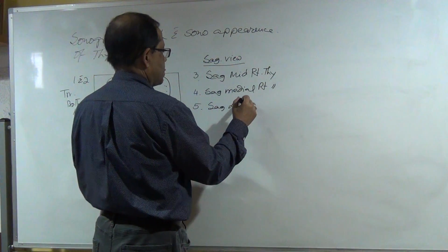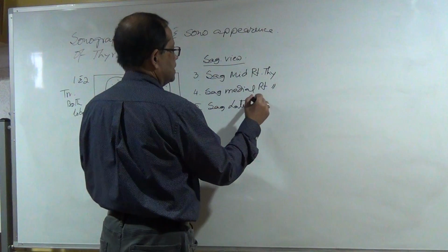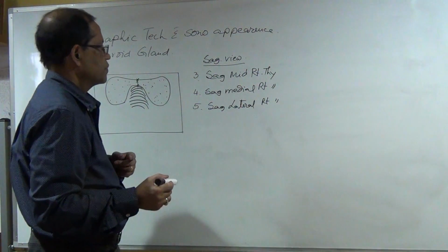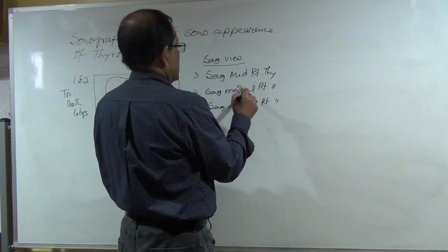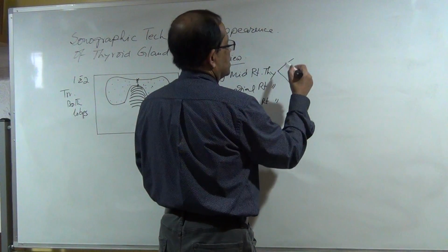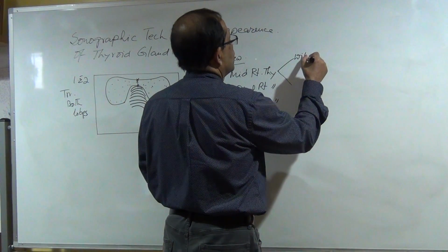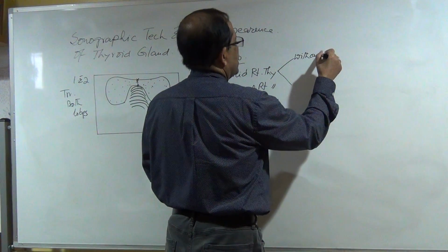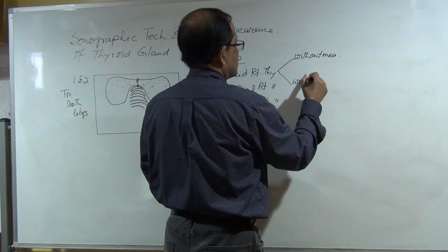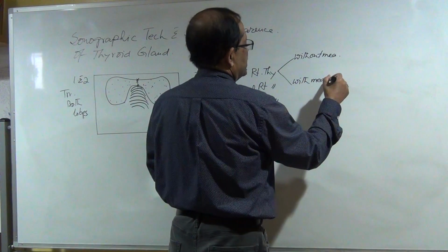Sag mid right thyroid without measurement and with measurement.